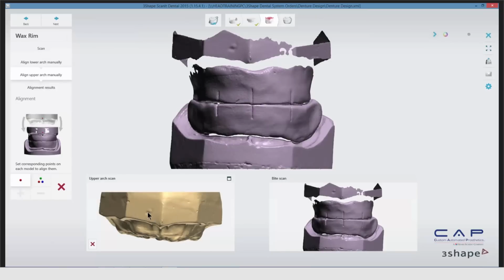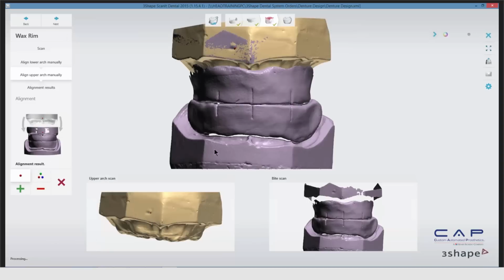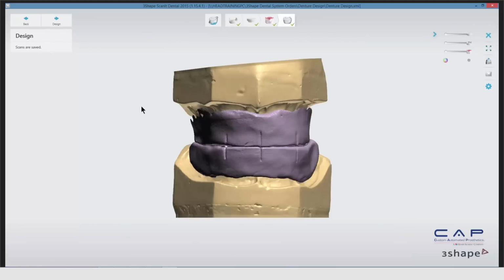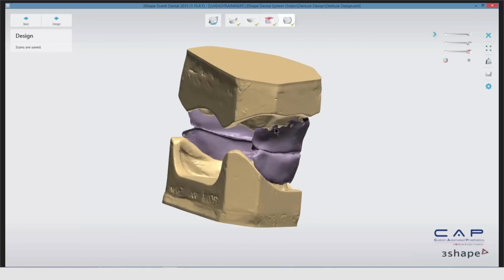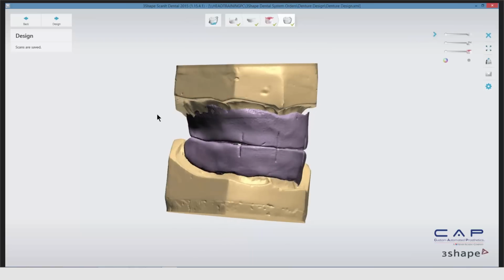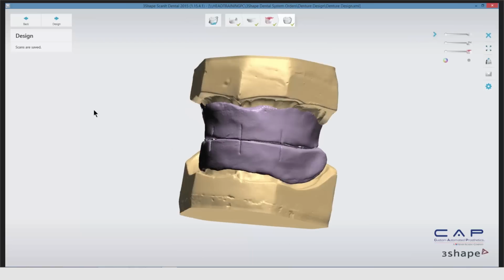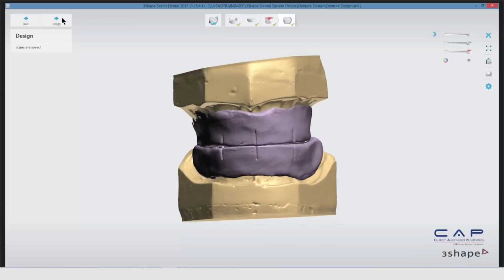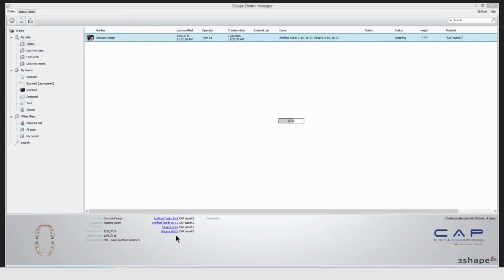So there's a little bit less that we have to align to, but really definitive marks that I can just go ahead and mark and get those set up together. Now once I have those all set, we have everything aligned and our scanning is done. All in all, it'll take about 10 minutes for this case, but this is on a D800, that's an old scanner. Normally a typical scan would take about 5 to 8 minutes to do. So let's go ahead and take a look at the design from now.